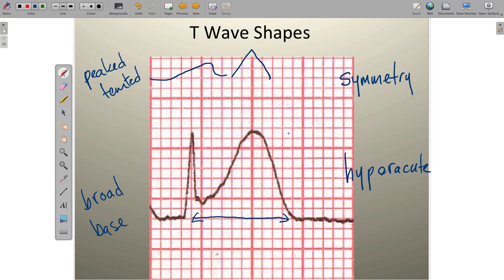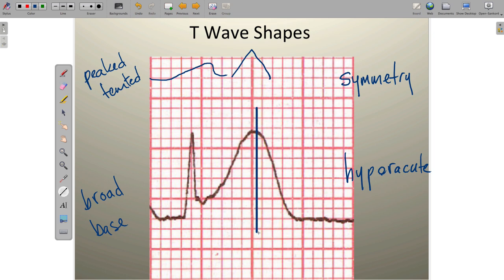Now we look at T wave symmetry. If we evaluate the T wave's left and right legs with respect to a vertical line that we draw, and compare the right leg to the left leg, you'll see that both kind of mirror one another — that speaks to the symmetry of the T wave. A normal T wave, no matter where you put a vertical line, should have no symmetry right to left — there should be a nice gradual upsloping ST segment into the T wave and a rapid return to baseline. Symmetrical T waves are always an abnormal finding.